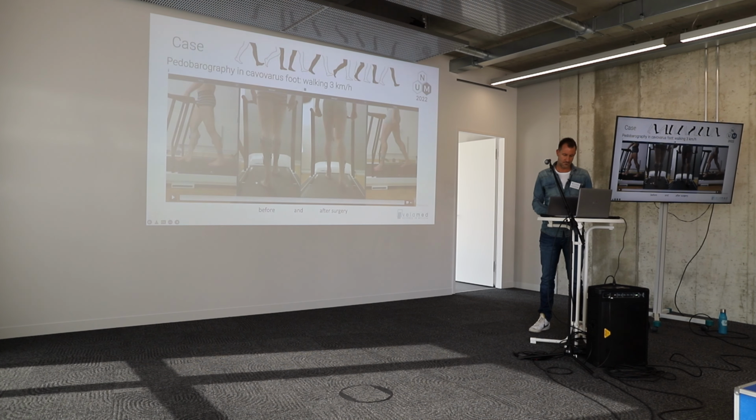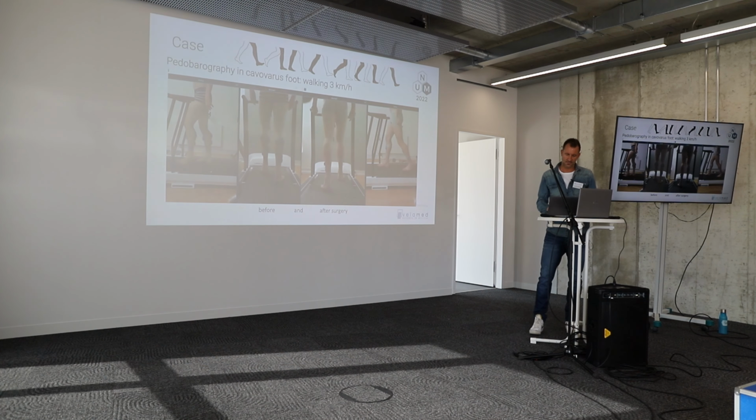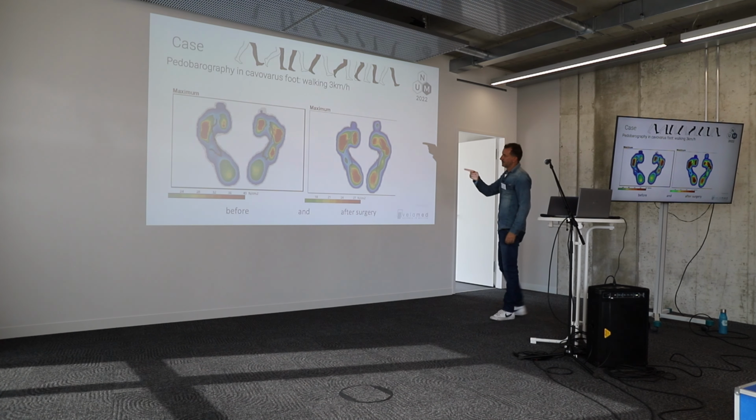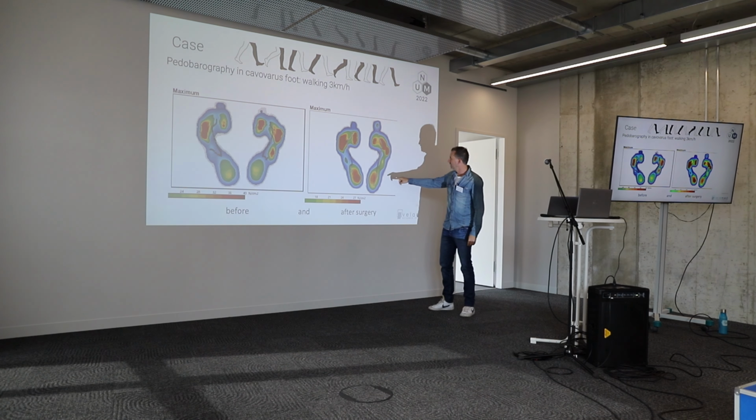Maybe you can show it again. And right now we have a plantigrade and orthograde foot pressure from the heel to the forefoot. And you can see this also here at the picture. So that is the left one before surgery, the right one after surgery. We can see that we have a heel pressure again.